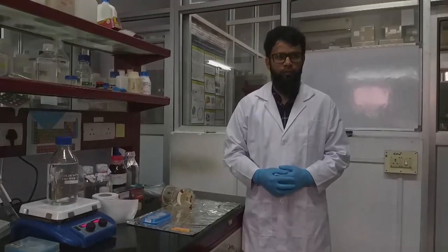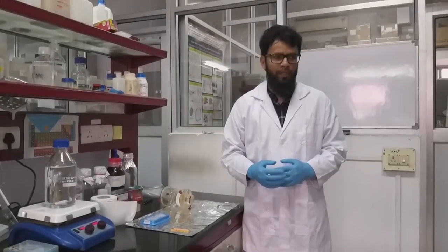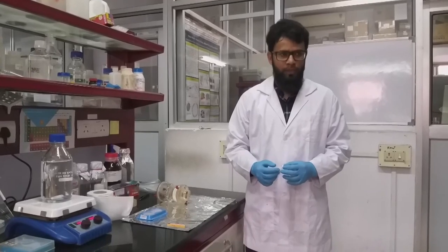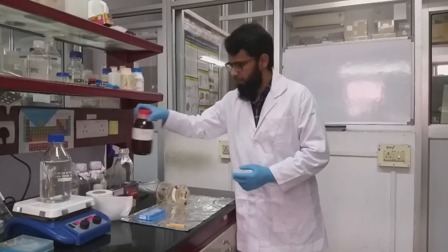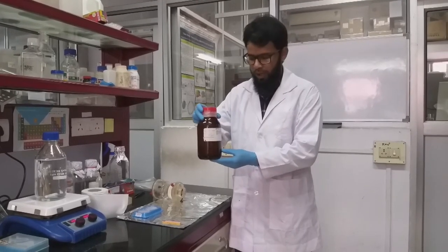In this video, we will be demonstrating how to prepare mammalian cell culture media. For that purpose, we need base cell media, which is DMEM, Dulbecco's modified Eagle's medium, high glucose.